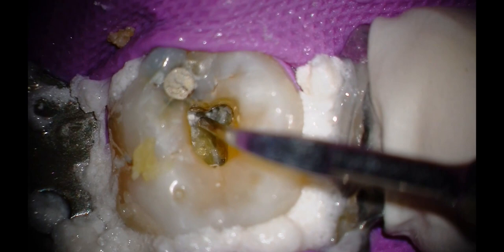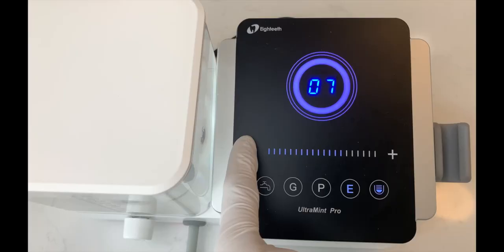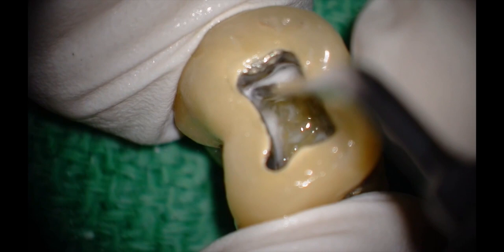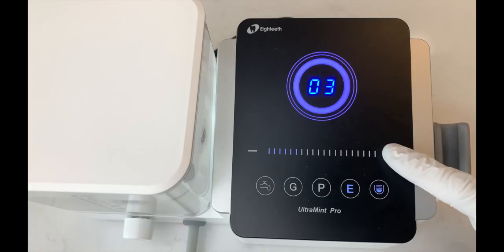The Ultramint Pro is compatible with almost every tip in the market and has a wide frequency range from 25 kilohertz to approximately 42 kilohertz. Adjusting the intensity of the tip is easily accomplished by pressing the plus or minus symbol on the smart touch control.